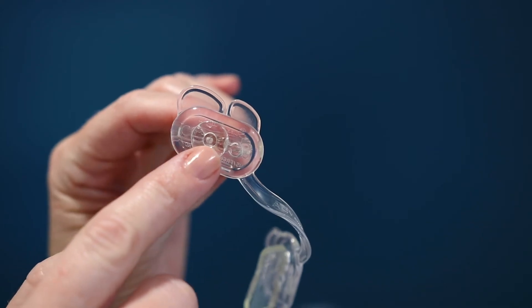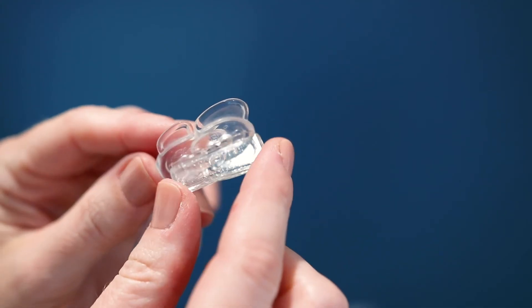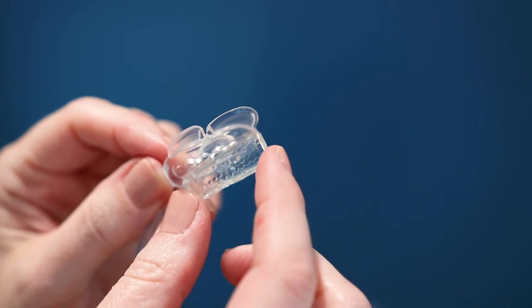If needed, you can adjust the bite pads forward for a smaller fit, or backward for a larger fit. As you rest your teeth on the bite pads, they automatically swivel to match the angle of your bite.